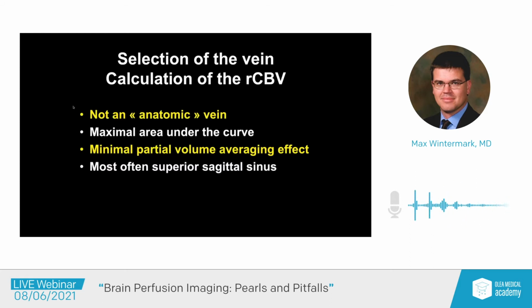So that has several implications that you have to think of. First, I don't have it here on a slide, but I want to mention it. If the patient's head moves a little bit during the acquisition, you may find a voxel in the brain where initially you have brain tissue, but because the head of the patient moves, suddenly the skull ends up in that very same voxel.